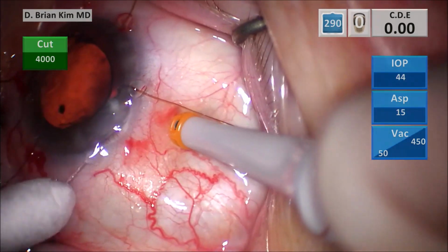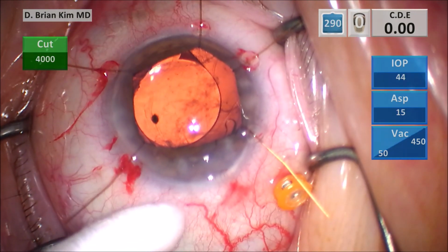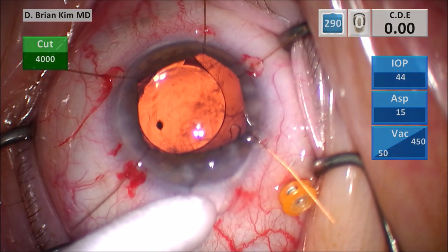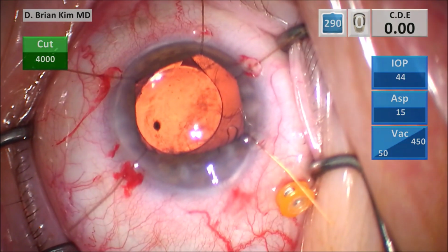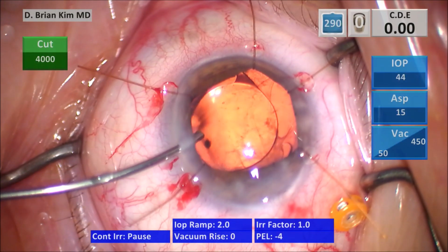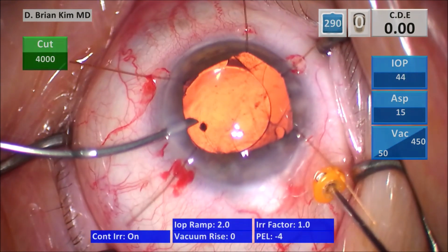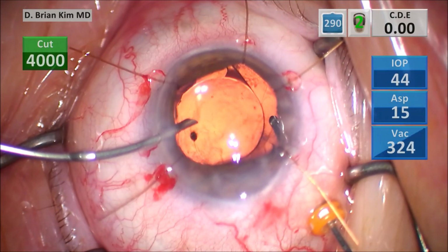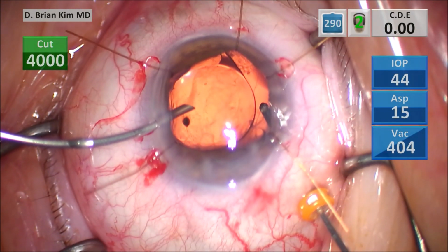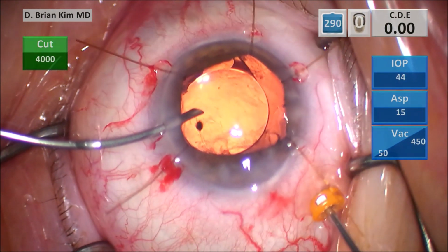But as I dove down, you saw that the main incision burped and there's a little bit of vitreous coming to the wound. Some of it's viscoelastic. Go ahead and quickly try to do some vitrectomy through the pars plana. And what's neat is as I do this, I immediately see the chamber deepening because while I was doing all those maneuvers with the IA, I could see that the lens was coming anteriorly as well as the lens decentering.